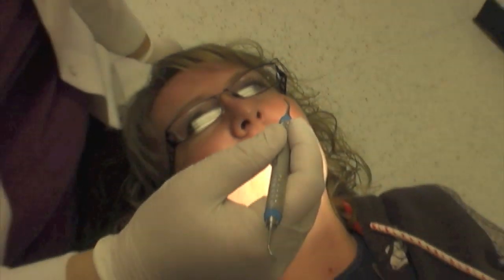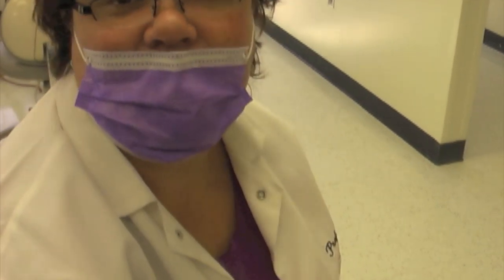So think about it — you don't have to just memorize that at 8 o'clock you have to be here, here, and here. Try putting the instrument to the tooth and just move around and see which is the most convenient location to gain access to an area. Wherever you feel most comfortable, you're going to realize, is the position that the instructor tells you to be in.